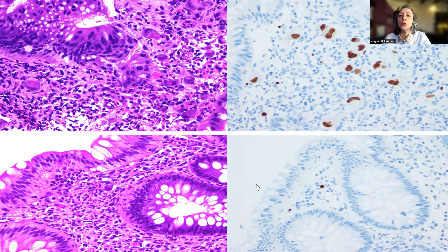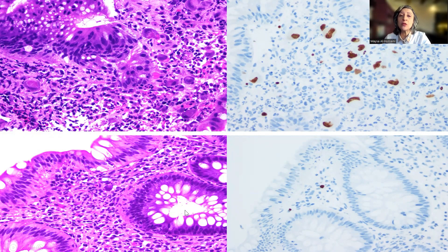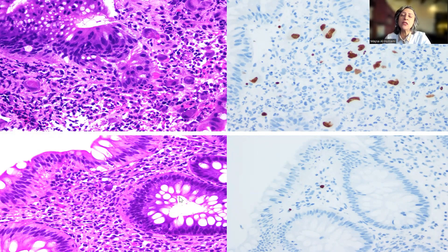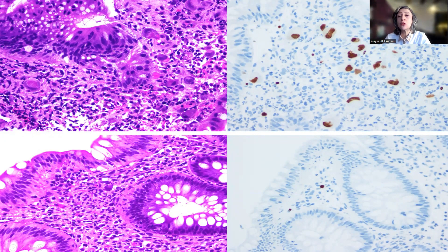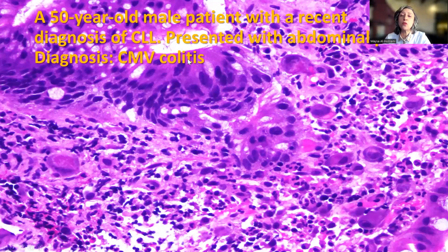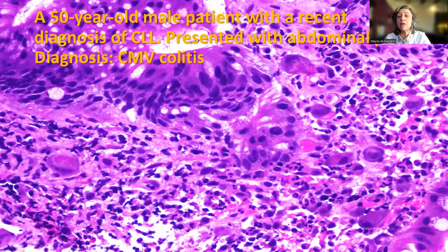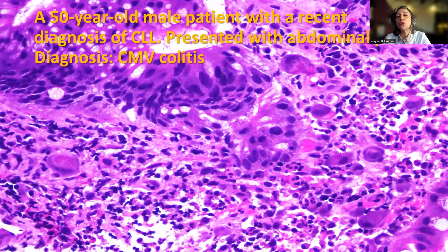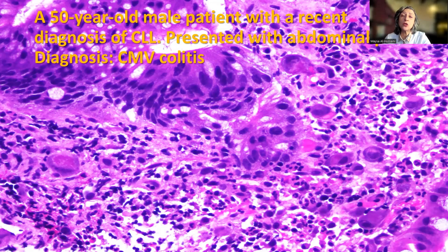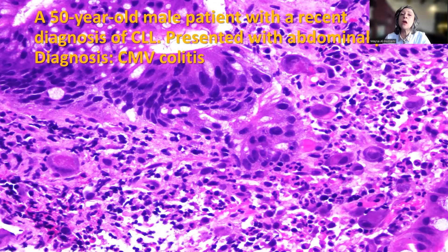Because of that, I always tend to perform immunohistochemistry for CMV virus on all bone marrow transplanted patient GI biopsies, because you can easily miss CMV infection and activation due to prior prophylactic treatment. The diagnosis for both patients is CMV colitis, but with a difference in microscopic appearance. If you don't pay attention to small details and don't apply CMV immunohistochemistry on all bone marrow transplant patients, you will miss the chance for rendering the proper diagnosis and thus the proper management of the patient.